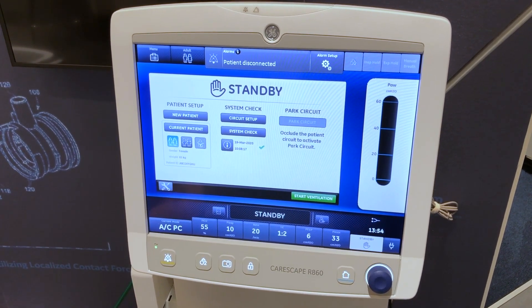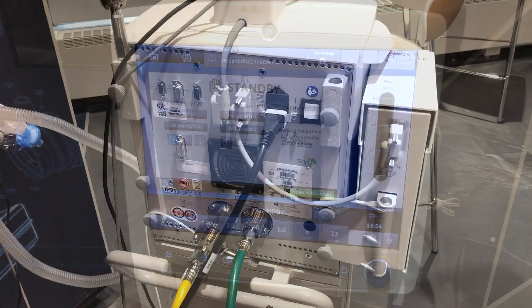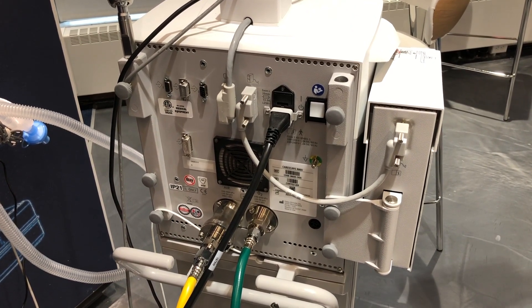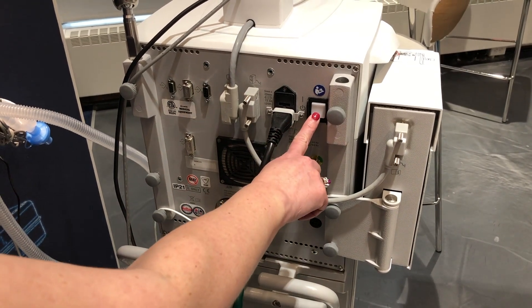Select cancel to continue ventilation if a warning message is displayed. To power off the system, select pause ventilation, then press the power switch on the back of the ventilator to the off position.